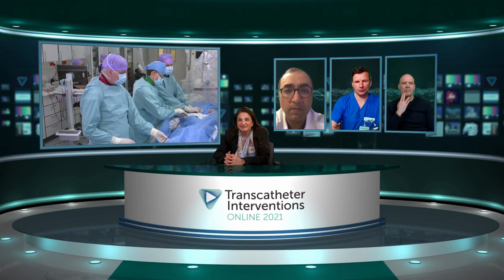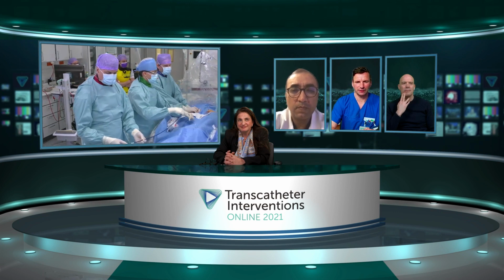So we do not do CTs in all the patients, only in very selected patients. Usually we just use TOE, and by this we do the sizing during the procedure. Maybe this is also important: we do not use general anesthesia. We are using conscious sedation, and with conscious sedation in the cath lab, you can easily do a left atrial appendage closure. Usually these patients are directly transferred to the normal ward after the closure, and we discharge the patient on the next day. So this can easily be done.